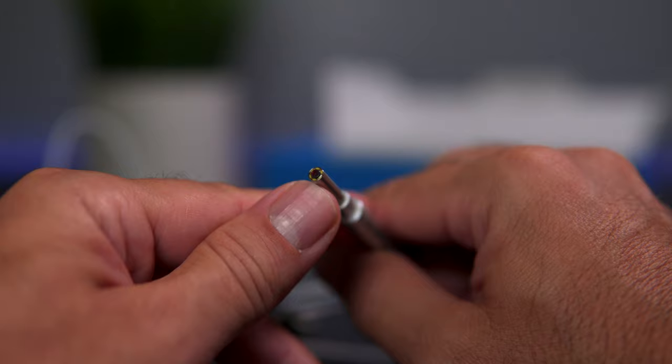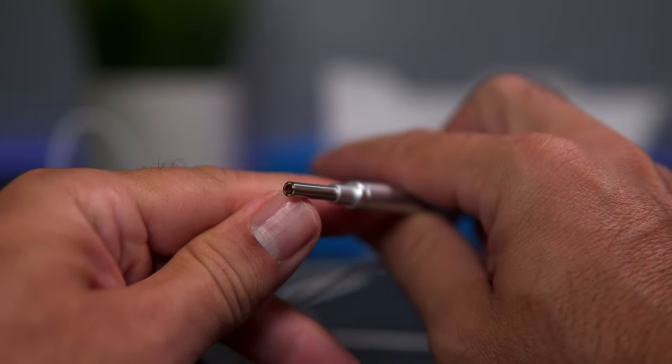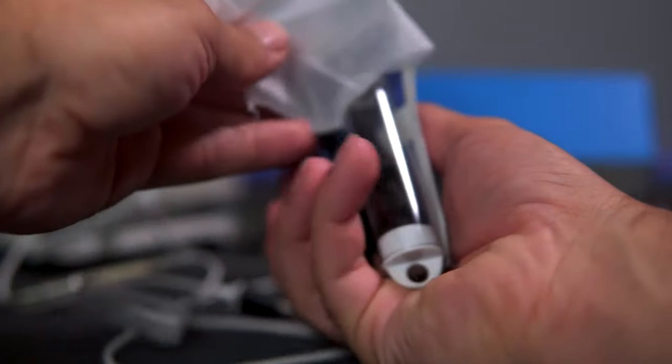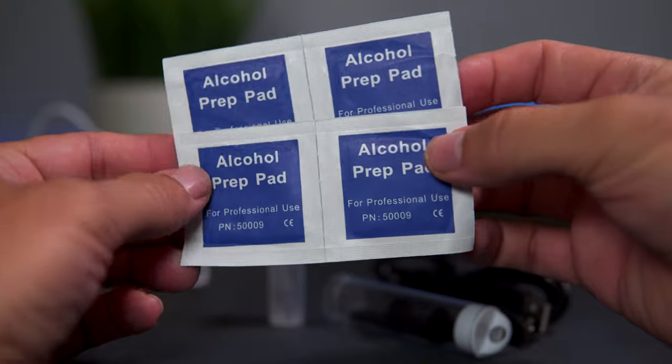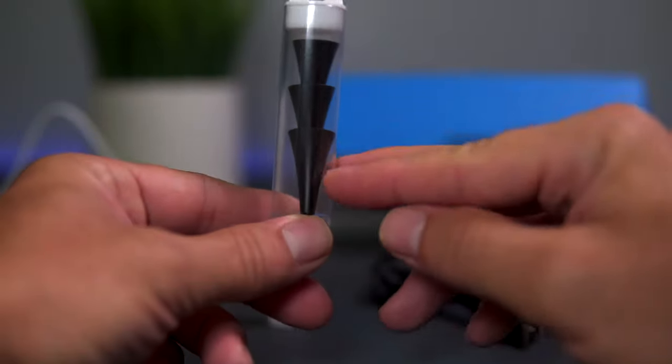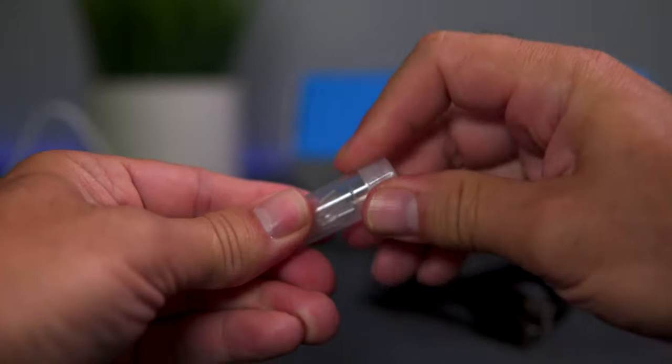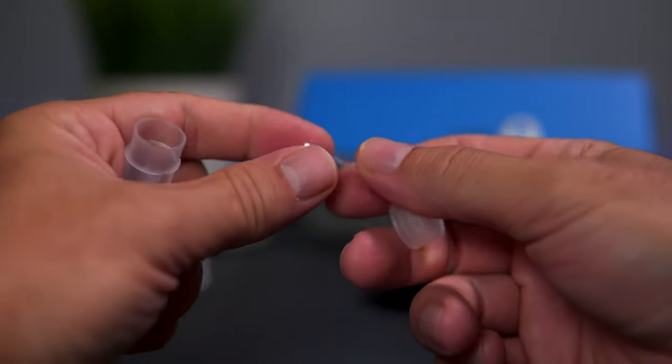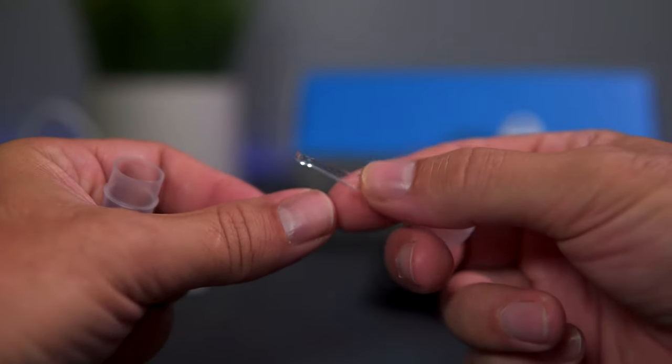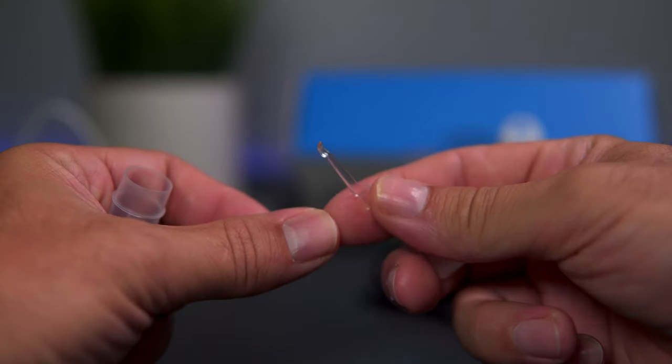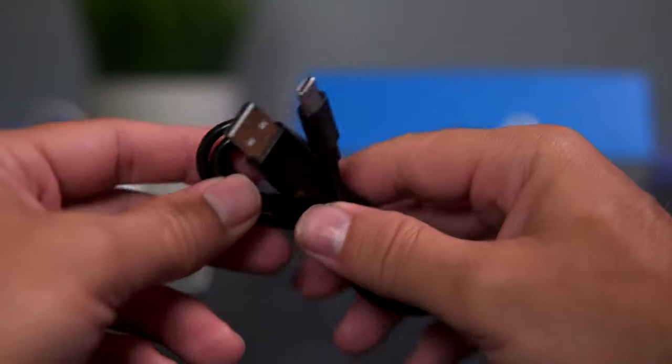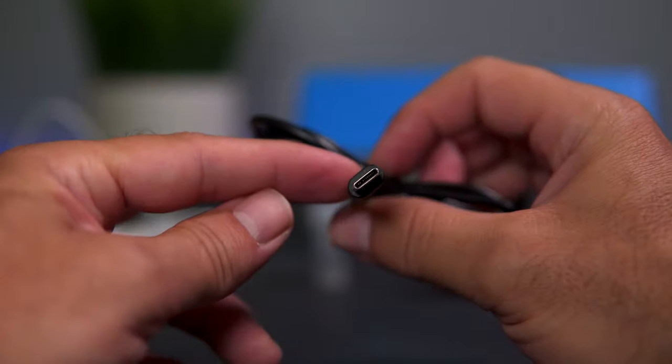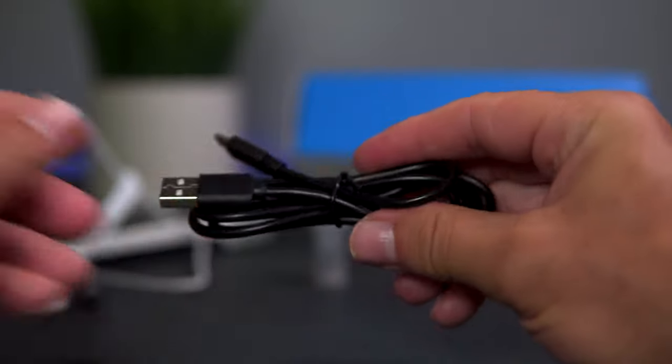We got one more baggie here with all the accessories. We have some alcohol prep pads, three ear cone attachments, and a few scoop attachments—there's four of these to scoop earwax and whatnot out of the ear. Here we have a USB cable, Type-C output to charge the device.